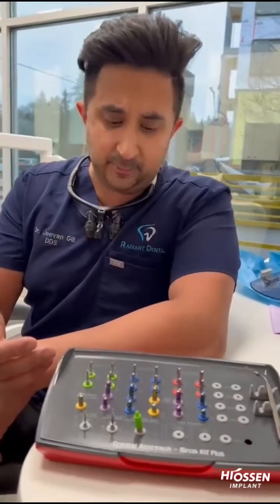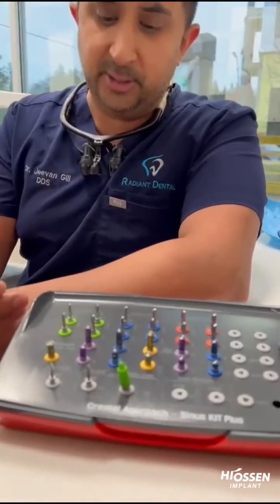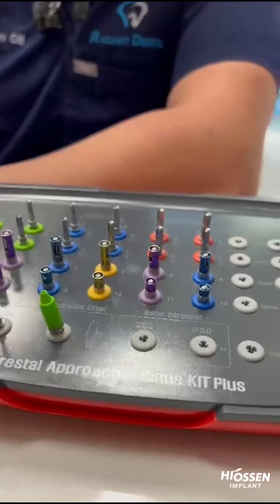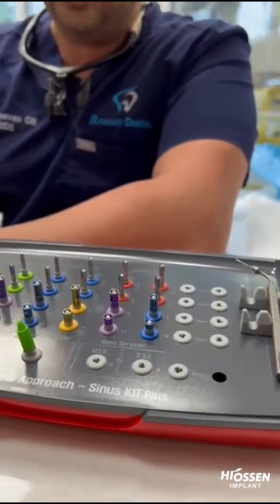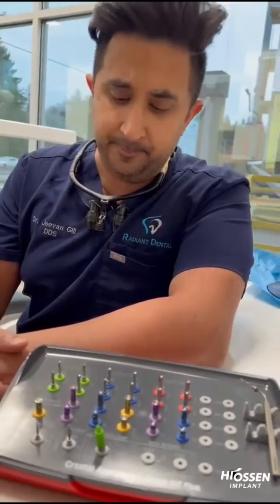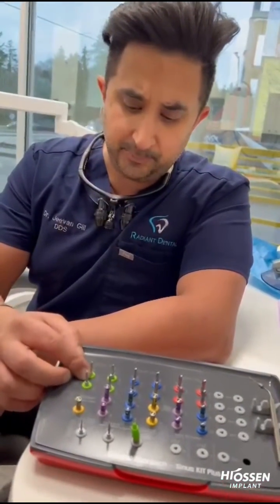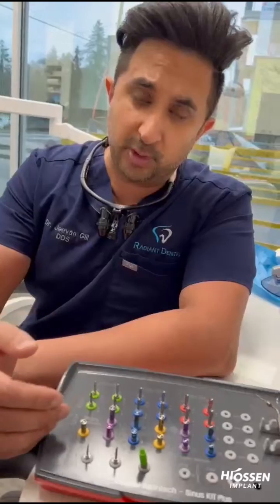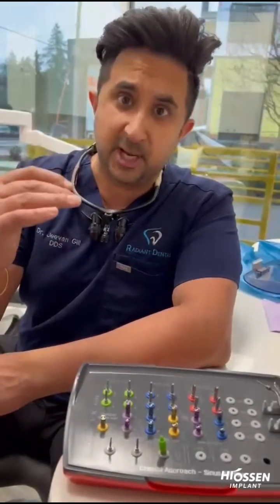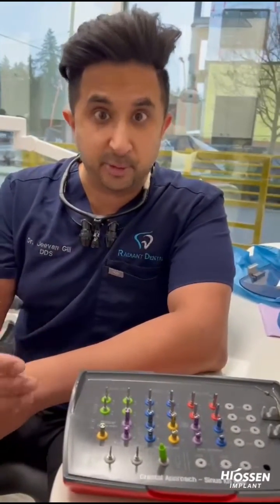Basically, the kit is self-explanatory. You're using the burrs for height when you measure for the sinus — you should have that through CBCT analysis or even through a guide. You want to drill to a millimeter just below where you know the sinus fenestration is going to happen. From there, you use the drills and go into sequential one-millimeter stoppers. The great thing about the kit is it's reverse cutting — the tip is safe, so if you drop into the sinus, you're not going to rupture the membrane.